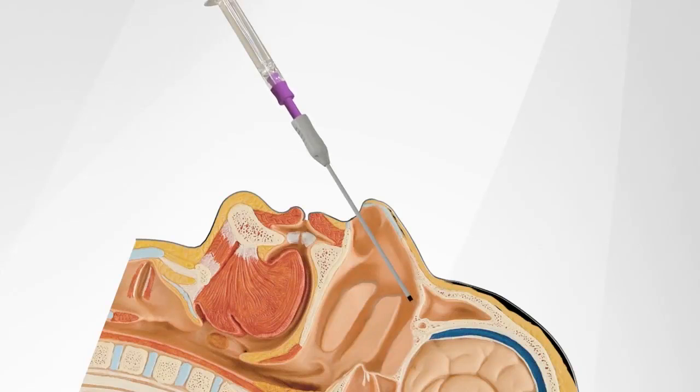The inner catheter is then advanced into the extended position by pushing on the purple hub with a gentle, equidistant push-pull motion to keep the inner catheter directed above the middle turbinate. During deployment of the inner catheter, it is important to move the gray hub and purple hub simultaneously in an equal distance towards each other. Now the SphenoCath is in position to inject 1.0 to 1.5 cc's of 2% lidocaine.